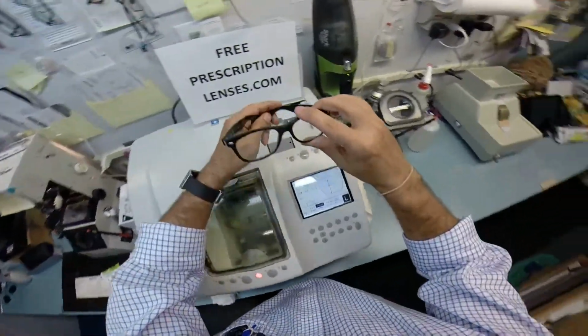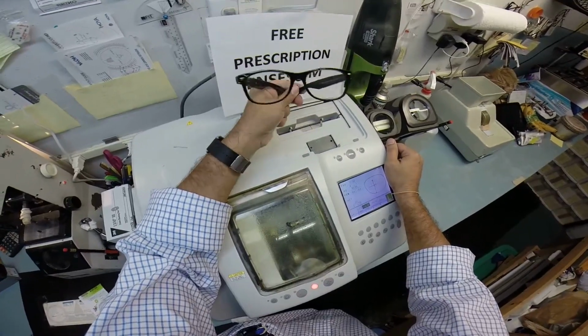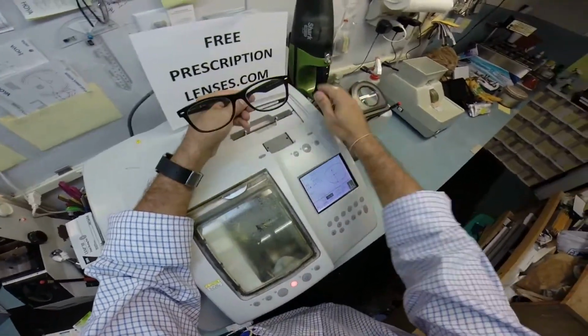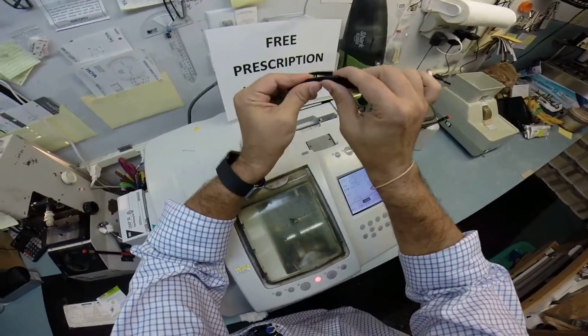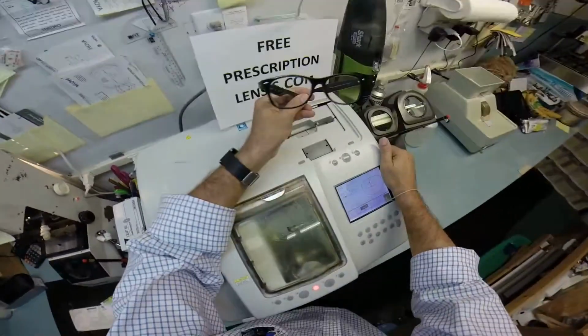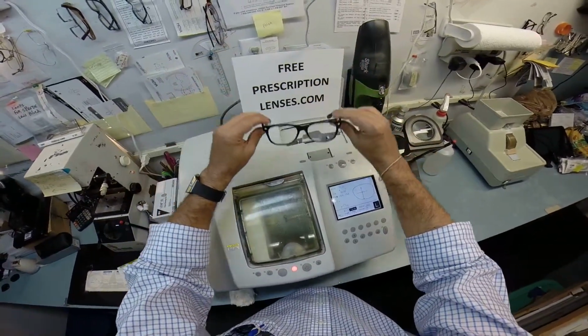So that's that. Again, should you ever need these adjusted, and you may have to do it about twice a year depending on the heat in California. High temperatures loosen the plastics where they slide a little bit more, and you just have to get these tightened back down over the ears. Takes about 30 seconds to a minute. It's no problem. Check out the magnification of the letters behind me.